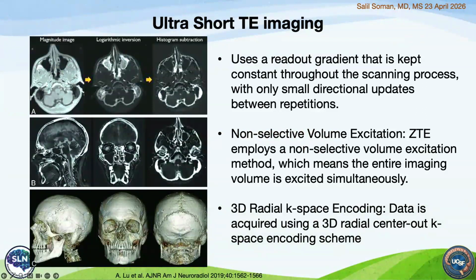But this is all obtained from a kind of MRI acquisition, and then you can reconstruct it in different ways to make it actually look like bone. And so GE has a package called OZTE that we can acquire on some scanners. There's a bunch of different others.